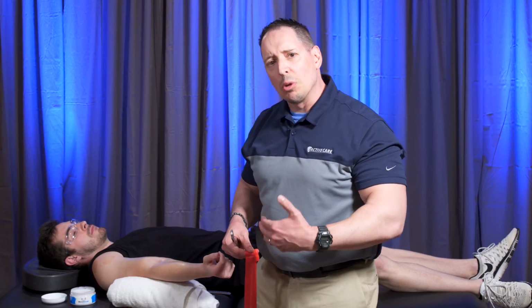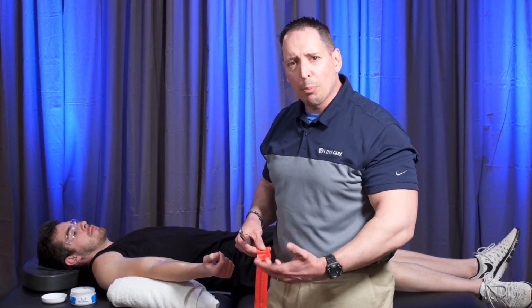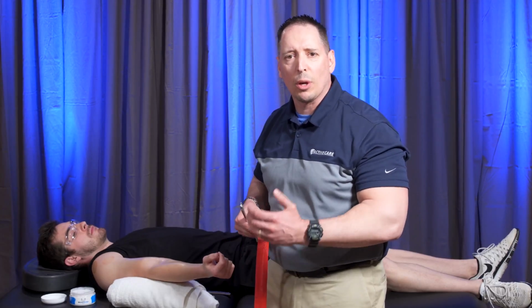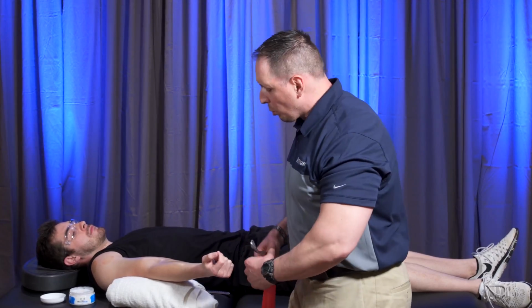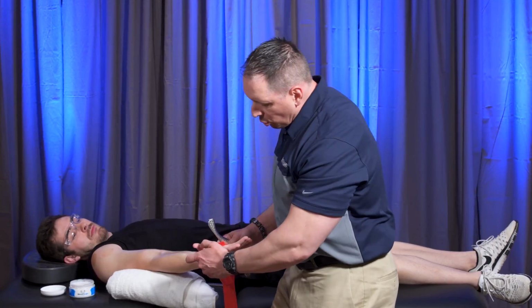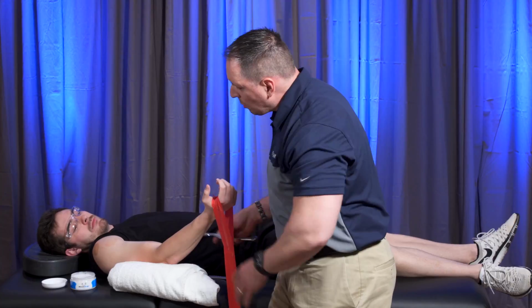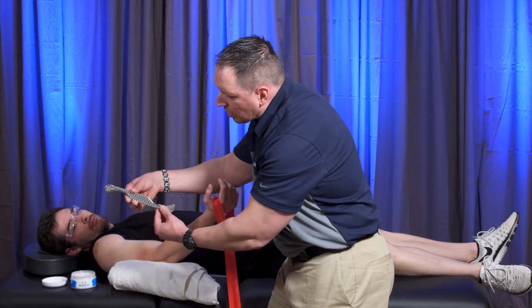So we want to lull that tissue into feeling good and comfortable and use the right amount of pressure at the right time with our patient in order to get elongation of those soft tissue structures that we're trying to have an impact on. So what I'll do now is I'll take the CLX loop and wrap this around the extremity. So we'll go ahead and hold right here. And I'm going to use multiple instruments at the same time.